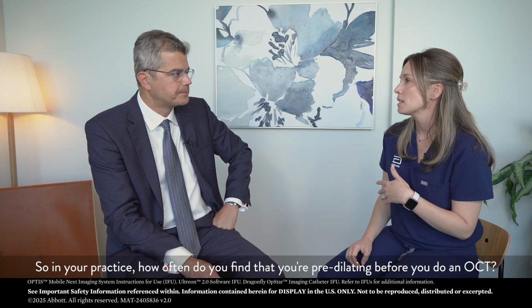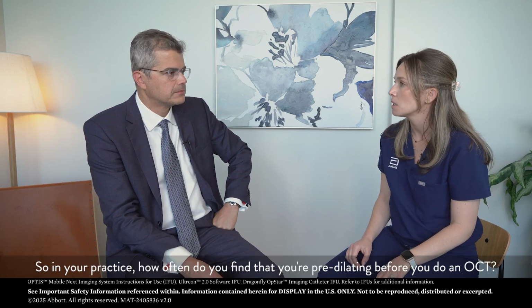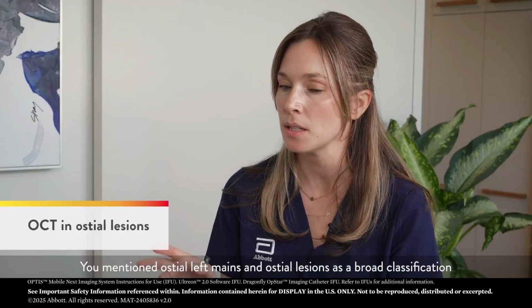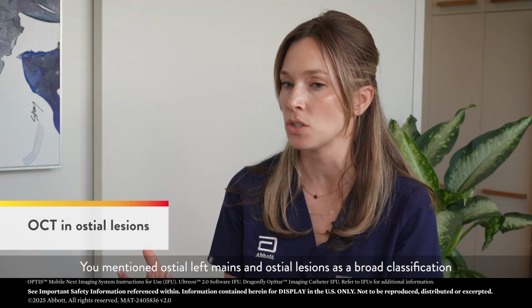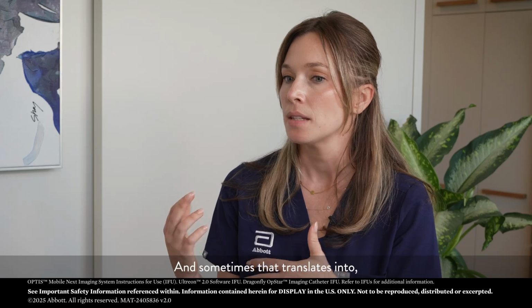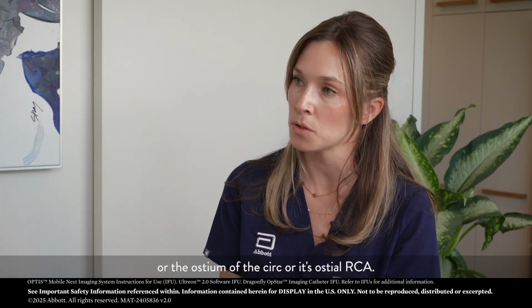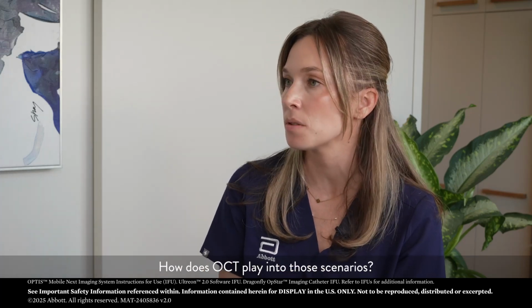So in your practice, how often do you find that you're pre-dilating before you do an OCT? Probably a third of the cases. Okay. You mentioned ostial left main, and ostial lesions as a broad classification is something that I get a lot of questions about in the field. And sometimes that translates into, oh, well, the lesion's at the ostium of the LAD or the ostium of the circ, or it's ostial RCA. How does OCT play into those scenarios?